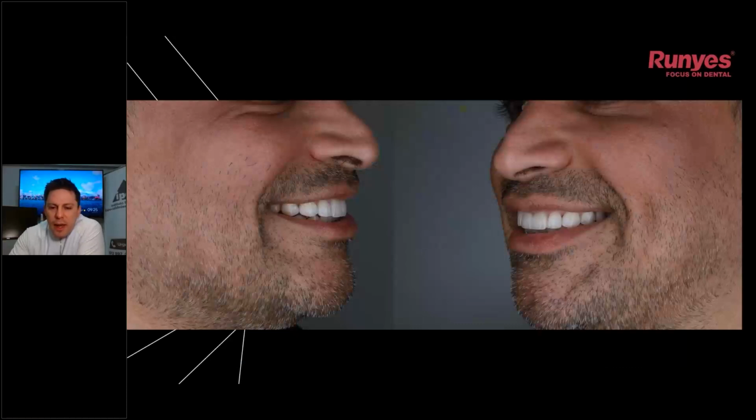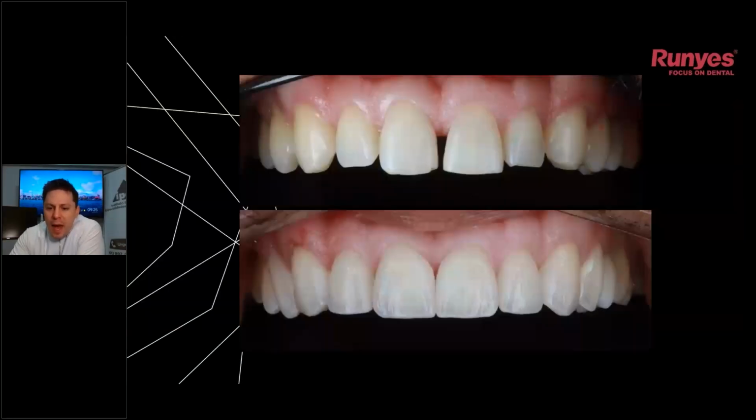We did gap closing veneers. These are monolithic veneers with a very, very subtle anatomy and texture, and we did a little bit of makeup on every single tooth.